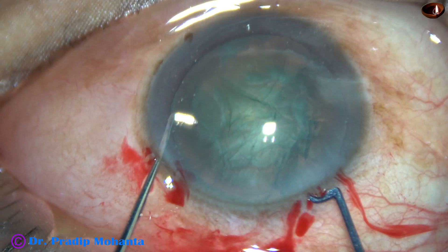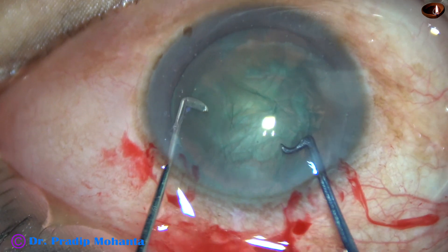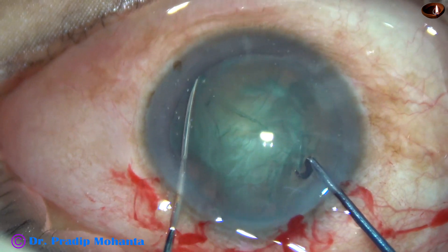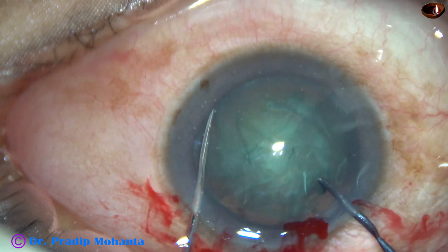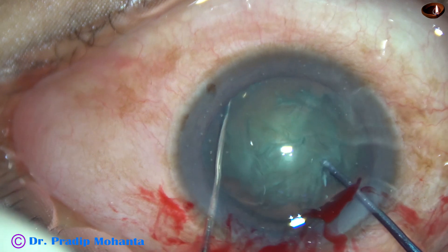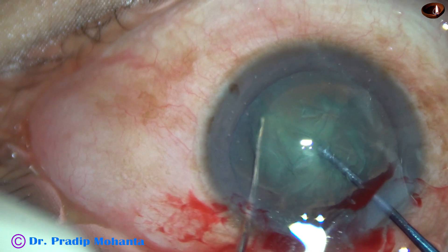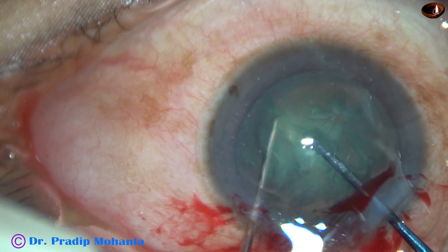Let us see it in slow motion. Here goes the pre-chopper. The sustainer — here it is a blunt chopper — hooks the equator of the lens and supports the lens, while the pre-chopper advances towards the sustainer.